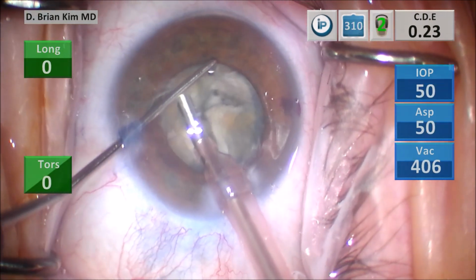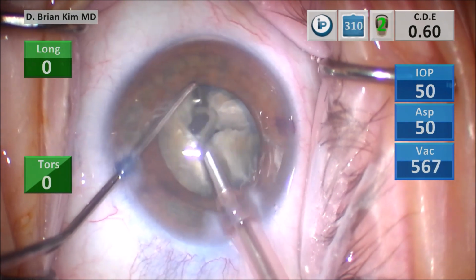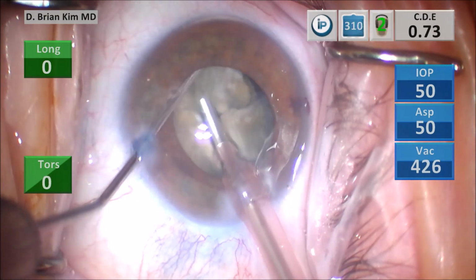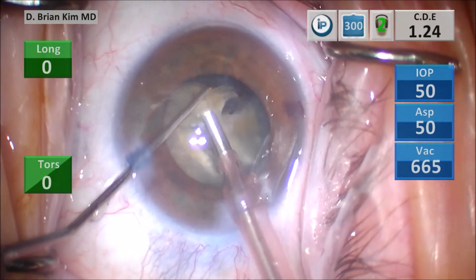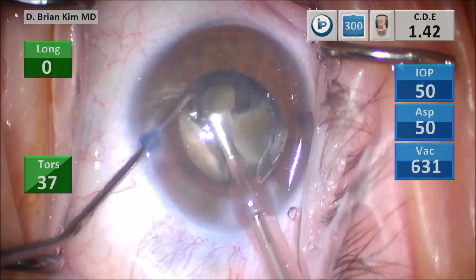There's a free piece there. There's another one right there. So I grab it with some vacuum, pull it up, and emulsify it. This is that fragment from the first quadrant. Lifting it with some vacuum, crushing it with the chopper and a fingertip, sandwiching it with mechanical forces, and then emulsifying the pieces there.